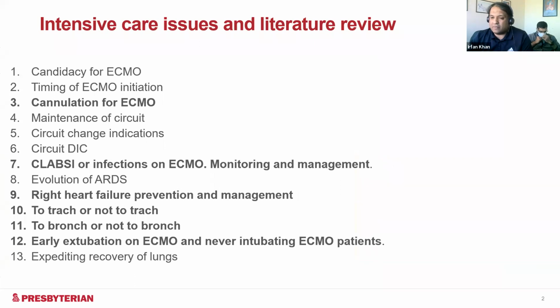So if you have, let's say, 2 ECMO machines and you have 5 candidates who need ECMO, you'll have to ration the care. So that's something that also has guided us in terms of helping us figure out who's a good candidate and who's not. And that has been changing all along.